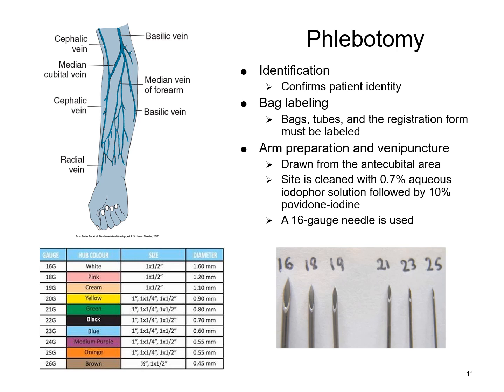So these are all important parts, but making sure that you prep the donor properly, making sure the arm is prepped properly, and that you perform the venipuncture properly is also important, because we need to maintain that closed system environment, so that we're not introducing bacteria. These products will be stored, so you don't want to be growing bacteria or some kind of organism in that blood bag that would lead to an infection or harm the actual recipient, because more than likely they're already having issues.